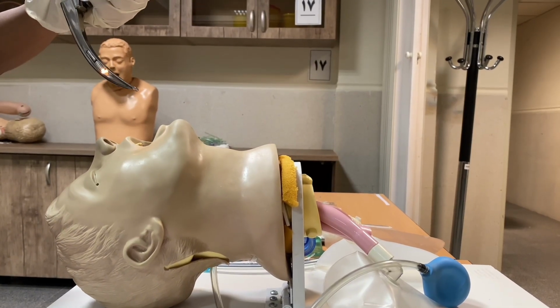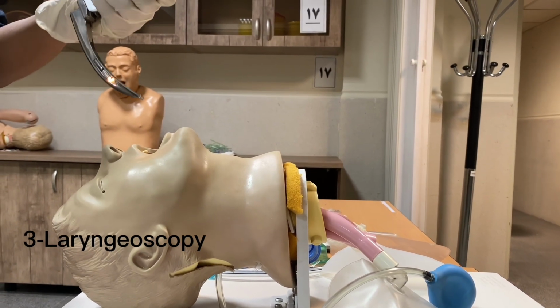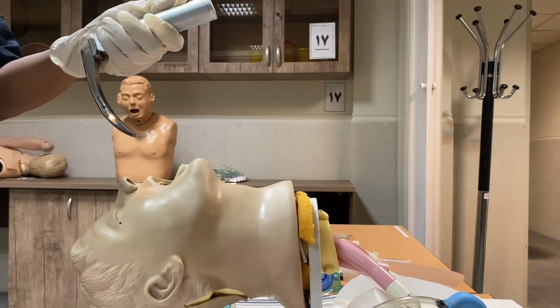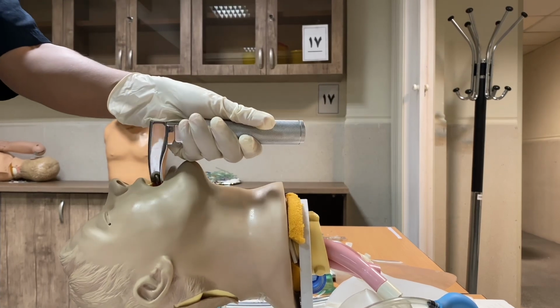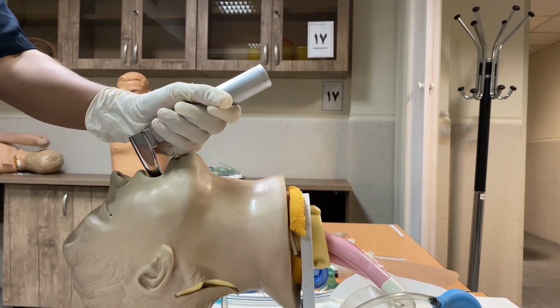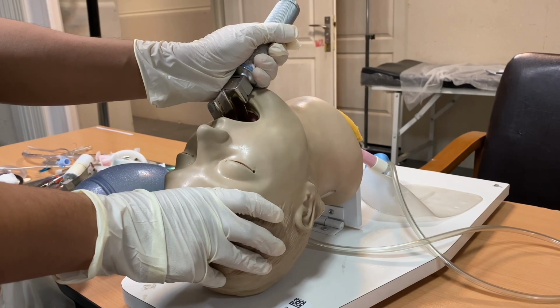The third step is laryngoscopy. In this step, I will hold the laryngoscope in my left hand with the blade facing the patient's mouth. I will insert the blade to the right side of the mouth, displacing the tongue from right to left. Then I will move my hand slightly forward. I will be able to see the epiglottis.